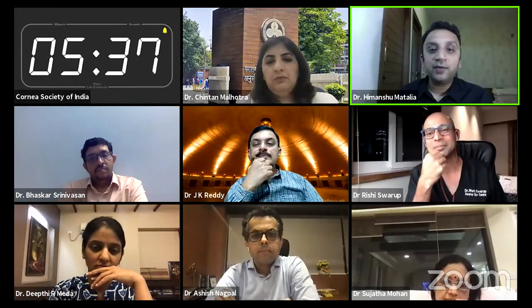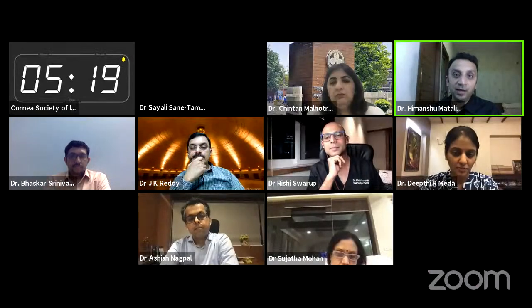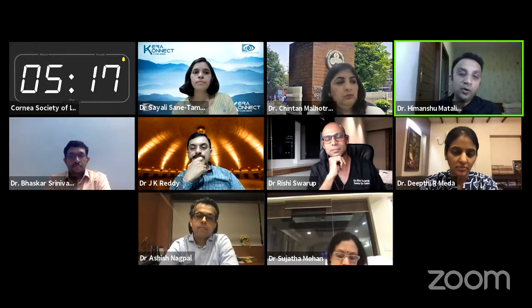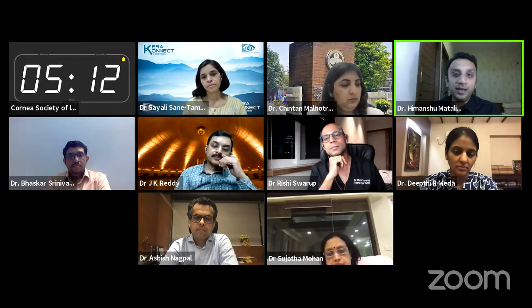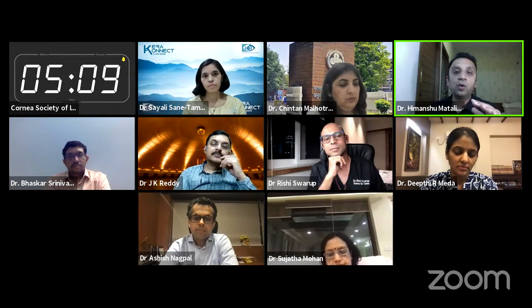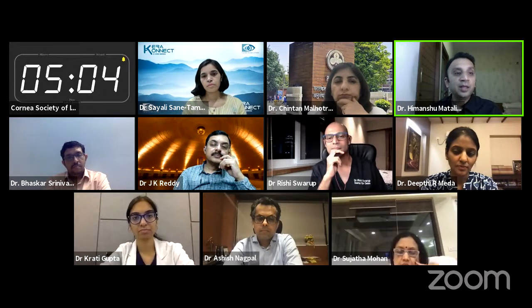Maybe do a PTK. So, yeah, I think Rishi had very valid points that if your irregularity is on the surface, your topography is going to be very irregular, and you may find it very difficult unless you use a masking agent. So if it is anterior to your basement membrane, just a de-epithelialization itself will make it very regular, and then you can do your treatment. If your scars are much deeper than that, then a direct refractive treatment like PRK or PTK may work much better.